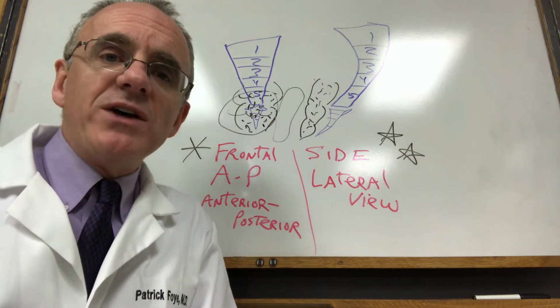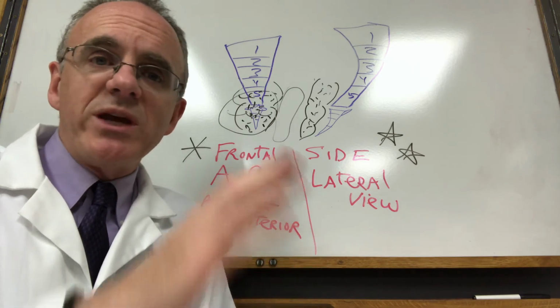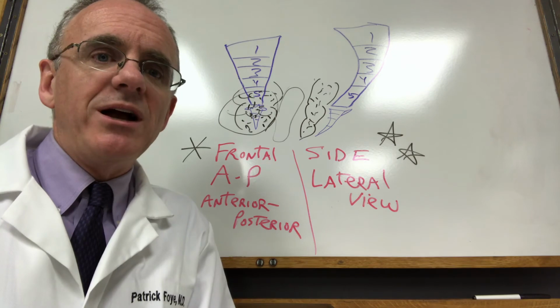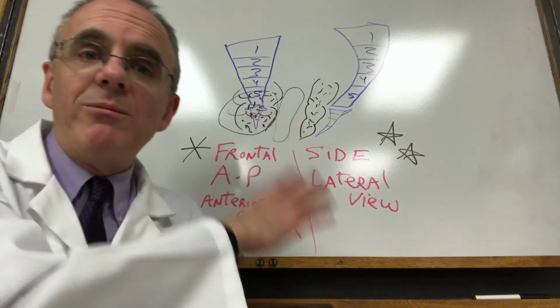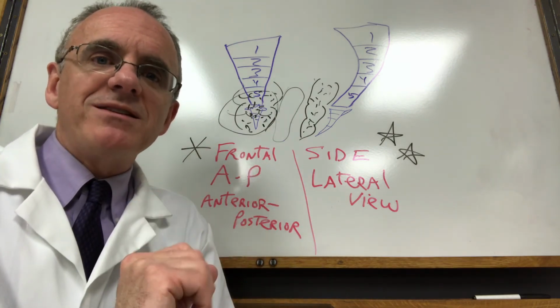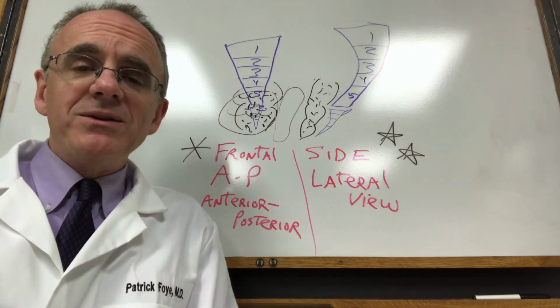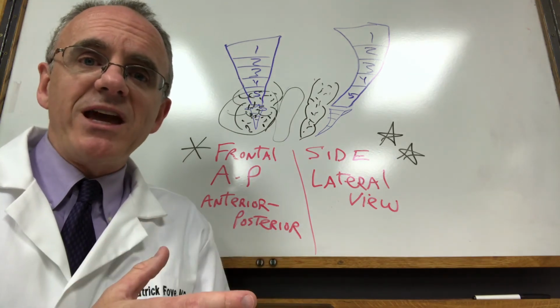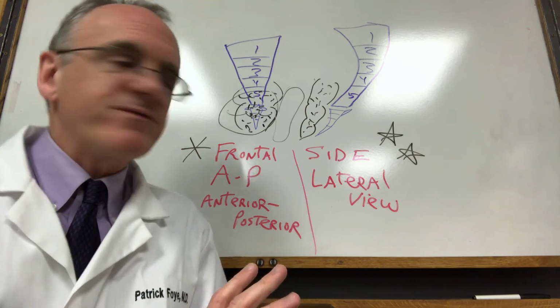Now beyond this, there's also having that lateral view done sitting versus standing, which we can talk about in another video, because that's really important as well, because there's lots of times where people may look normal while they're standing up, but when they sit and put their body weight onto the tailbone, which is usually when they're most painful, they may have an abnormality or dislocation that only shows up on the sitting x-rays. But that's for another video. So on this one, just simple things first.